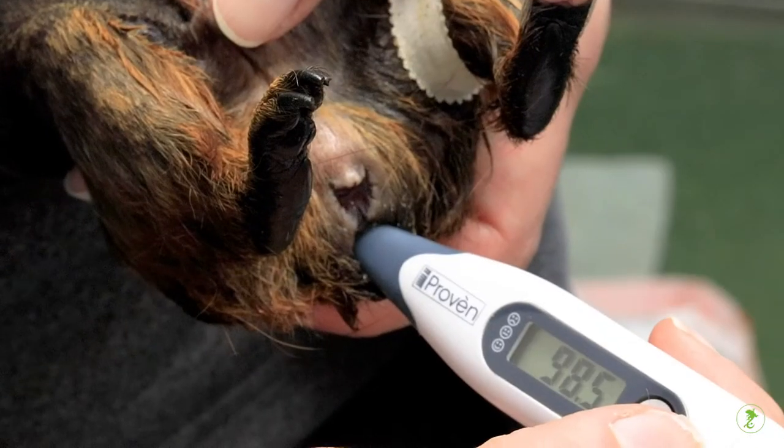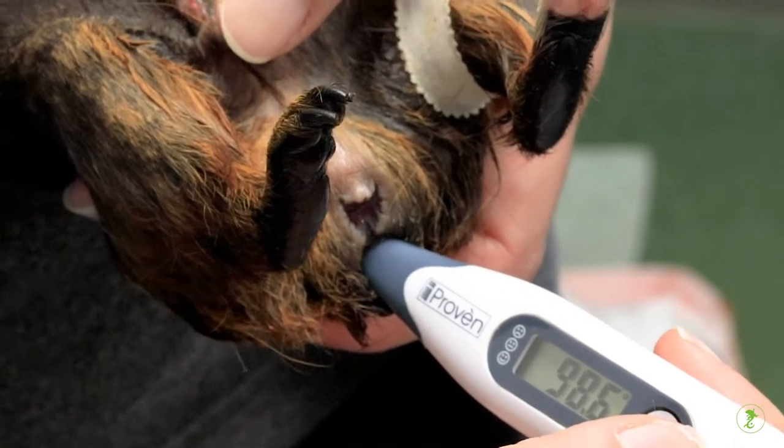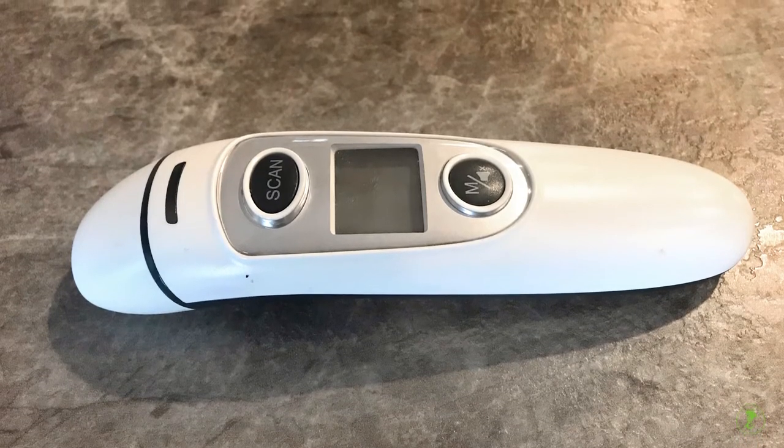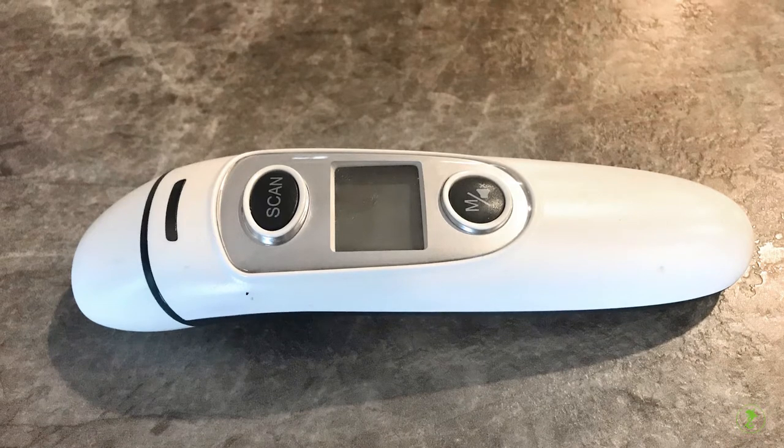The most accurate way to measure temperature is with a regular thermometer used rectally. The accuracy of thermometers used to measure temperature from the ear or the skin has not been well worked out in most exotic pets.